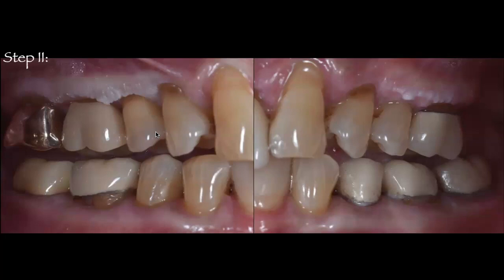And of course, in order to control how fast or how much these teeth are intruding or extruding, what I do the same day that I fabricate these mandibular prototypes is obtain a bite registration with Regisil of the left and the right side. I only put Regisil on the occlusal of the premolars and molars on each of these sides, and I have the patient bite down until my prototypes come into contact.